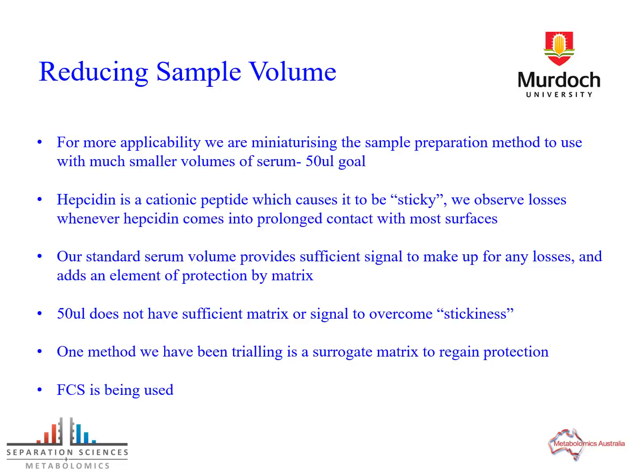One of the focuses we have is we want to be able to miniaturize or reduce the sample volume for our methods, so that we can use much smaller volumes, and certainly for children that's a real plus if we can reduce the volume of serum or plasma required, as well as developing urine in parallel.